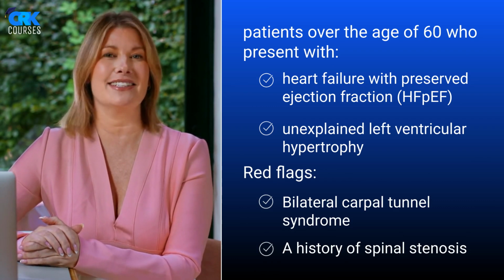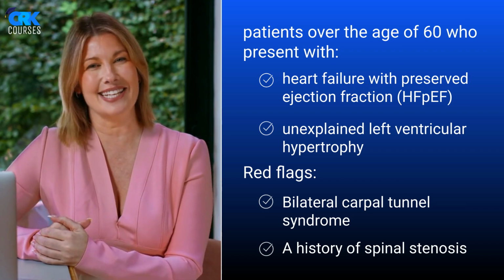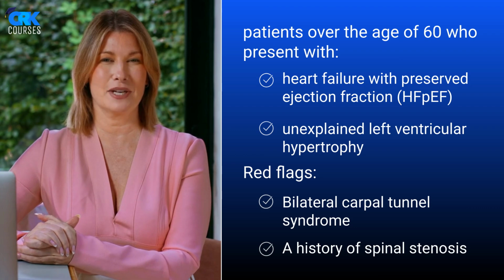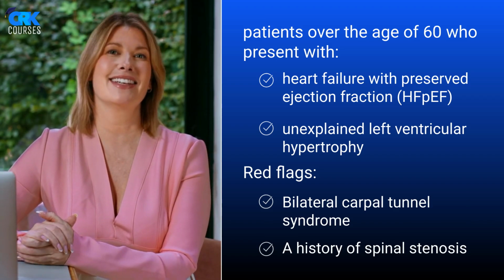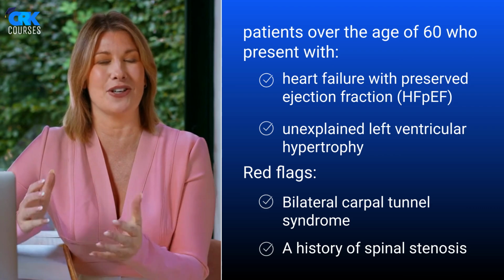In these patients, the presence of grade 2 or 3 myocardial uptake on technetium-labeled bone scintigraphy, such as 99mTc-PYP, DPD or HMDP, in the absence of monoclonal protein, is diagnostic for ATTR-CM. No biopsy is needed in such cases, and the diagnosis can be confidently established using non-invasive methods.